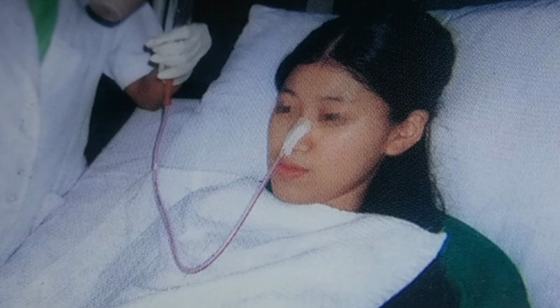After making the comfortable position, we have to wash our hands and wear gloves. Spread the towel and Macintosh over the patient's chest. We have to place the towel and Macintosh on the patient's chest side. Why are we putting it? If anything spills while we are feeding, it will cause disturbance to the patient. At the same time, the bed sheet and the patient gown will get soiled. So we use the towel and Macintosh to cover the patient's chest.